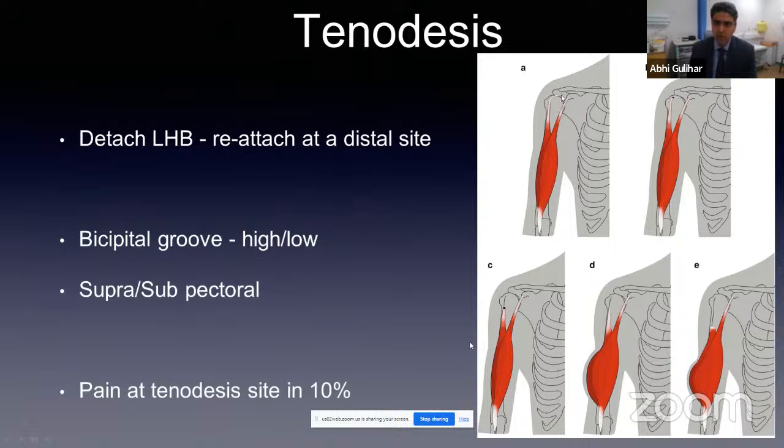So for example, image A is normal. Image B shows high bicipital groove tenodesis. And I've only had to do this when I am not expecting a biceps pathology, and when we go in there, you have a partial tear. So similar to the patient I showed earlier. And this is because we don't normally have the tenodesis screws. We would use the standard anchors for this.